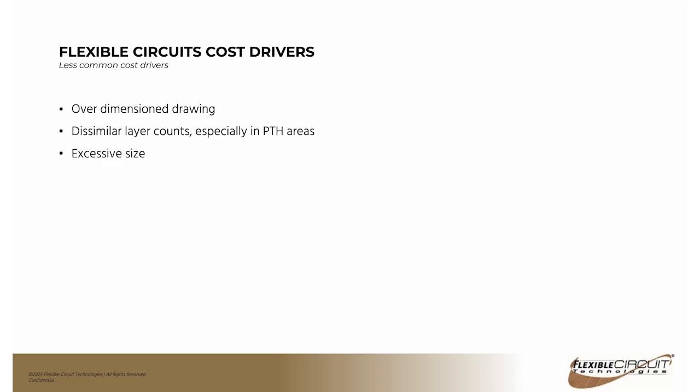And so whatever your hole size in the top, it's going to be smaller on your landing pad depending how deep you go. And so you want to keep that as large as possible. As far as the tolerances on other features, size and shape, I try to make everything reference that's not critical. Again, put only critical features with full dimensions, make everything else reference, or just leave it off completely and let the Gerbers drive the application.